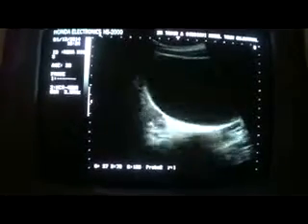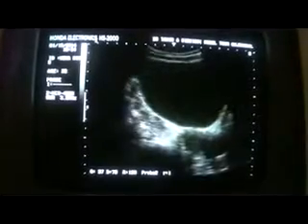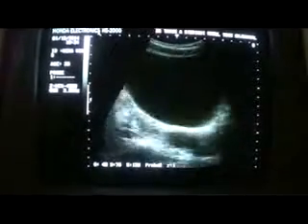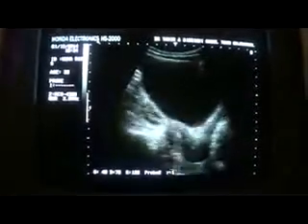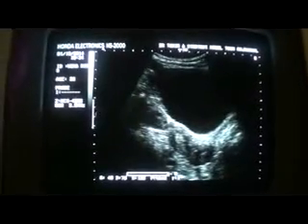Now, what else? I'm going to show you the uterus. This is the uterus.